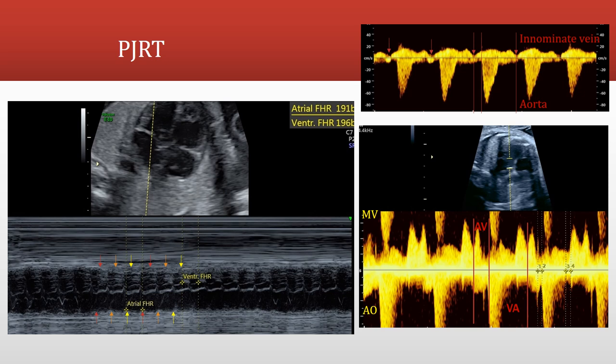Looking at PJRT images: on the M-mode, you can clearly see one-to-one conduction. On the inflow-outflow image, the measured AV and VA intervals show that the AV interval is shorter than the VA interval. The same finding is seen on the parallel artery and vein image using the innominate vein and aorta, confirming these measurements on multiple modalities.